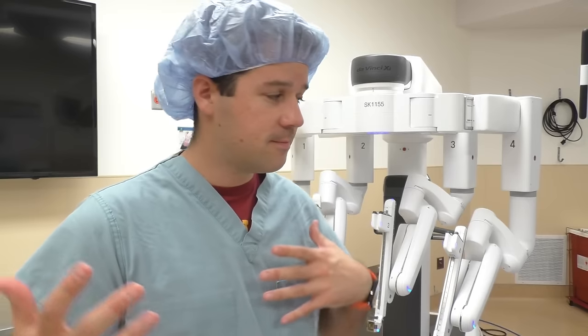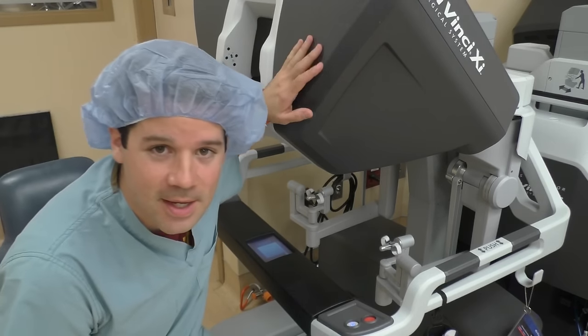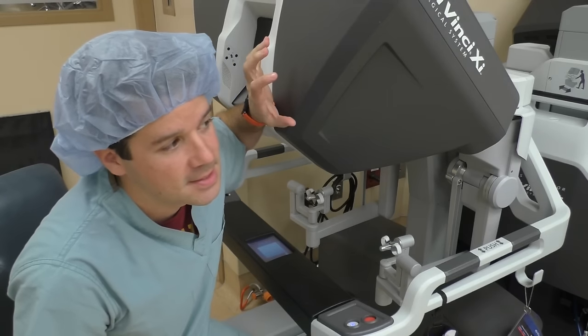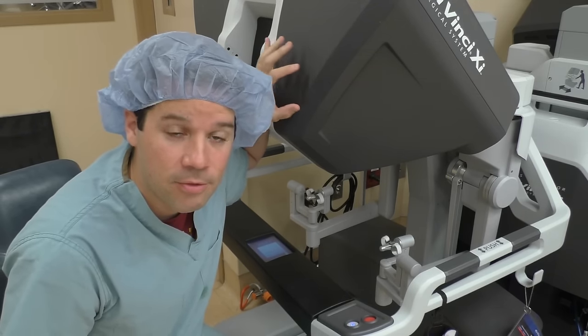So let's get started with kind of a brief overview of the robotic systems in the room. The first thing I want to go over is this unit here — this is the console, this is where the surgeon will be sitting and operating through.